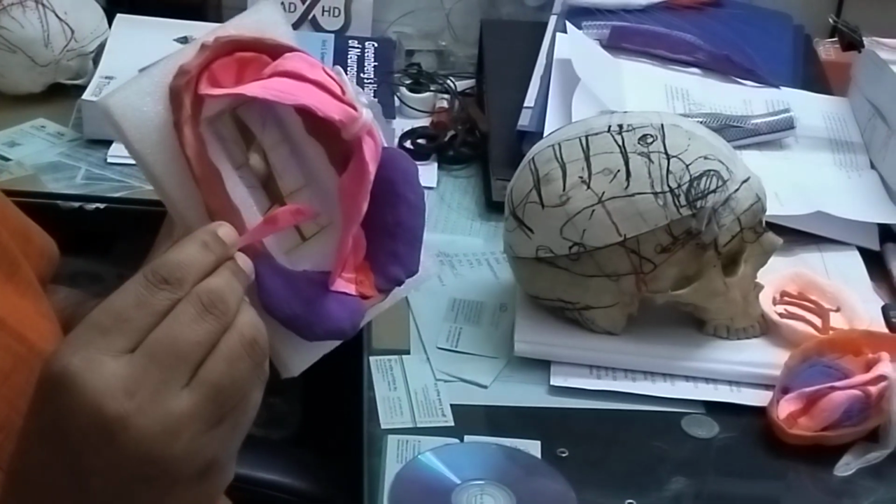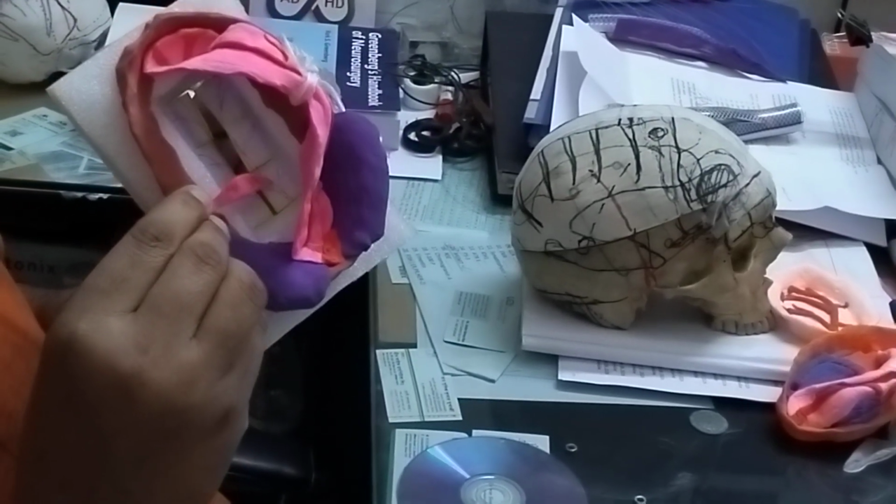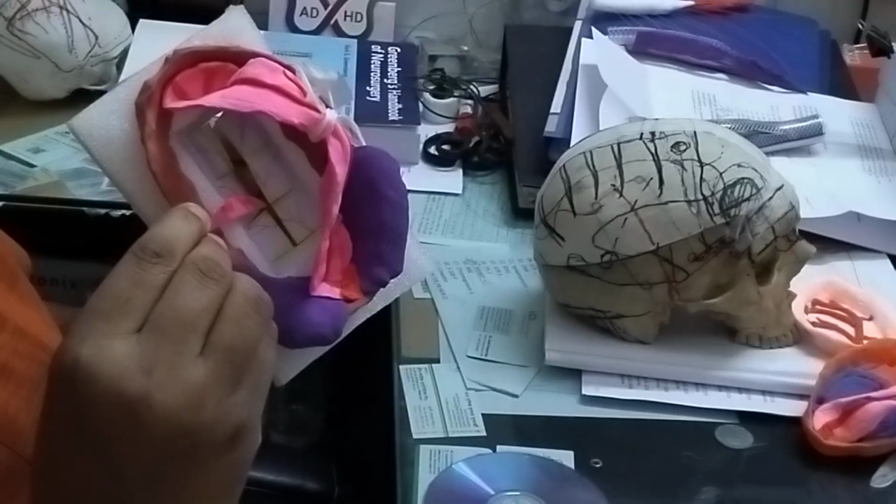The red color is the middle meningeal artery over the dura.